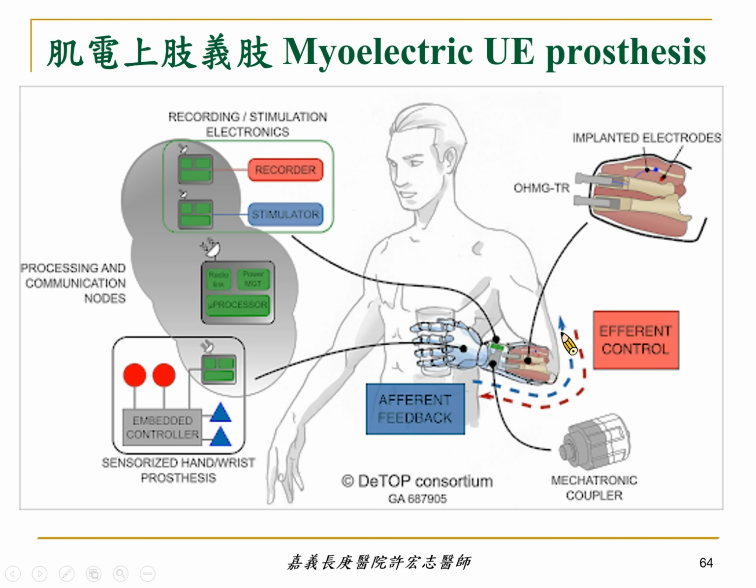They have differential sensors within the proximal part of the prosthesis, and once you attach them to your upper limb remnant, it will sense the muscle activity and form different signals to do postures like grasping or pinching. We call that the myoelectric upper limb prosthesis.